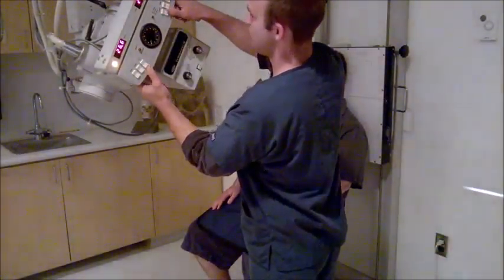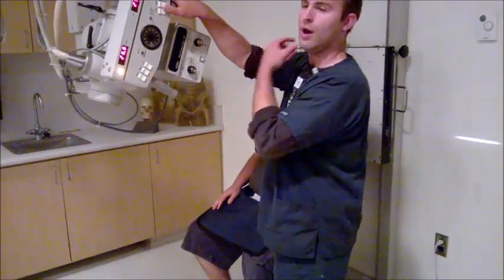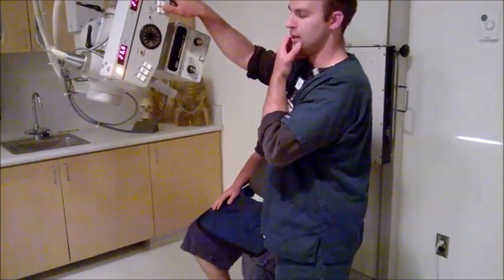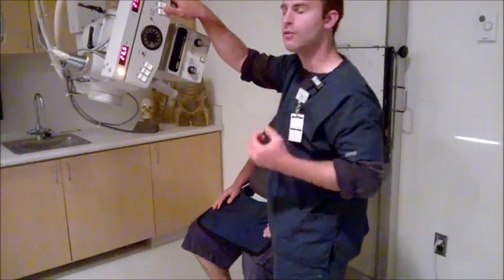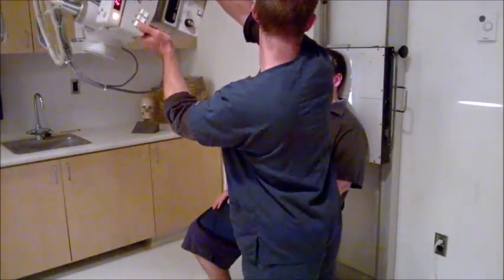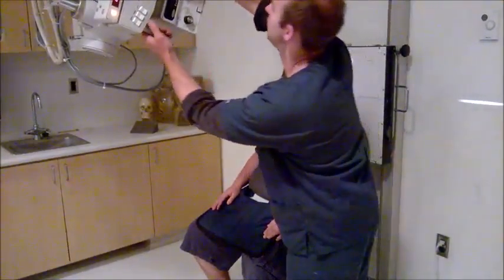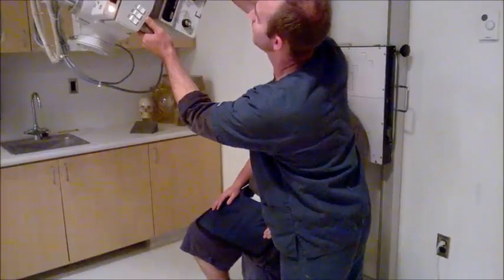So, there we go. This tends to bring out the rami. It extends the rami. There we go. CR enters the glabella. Let's see, 40 degrees right there.